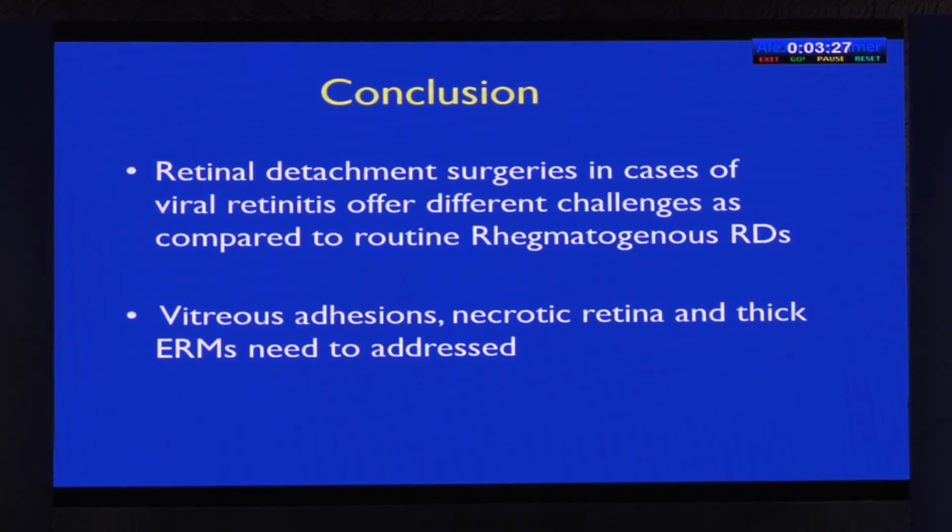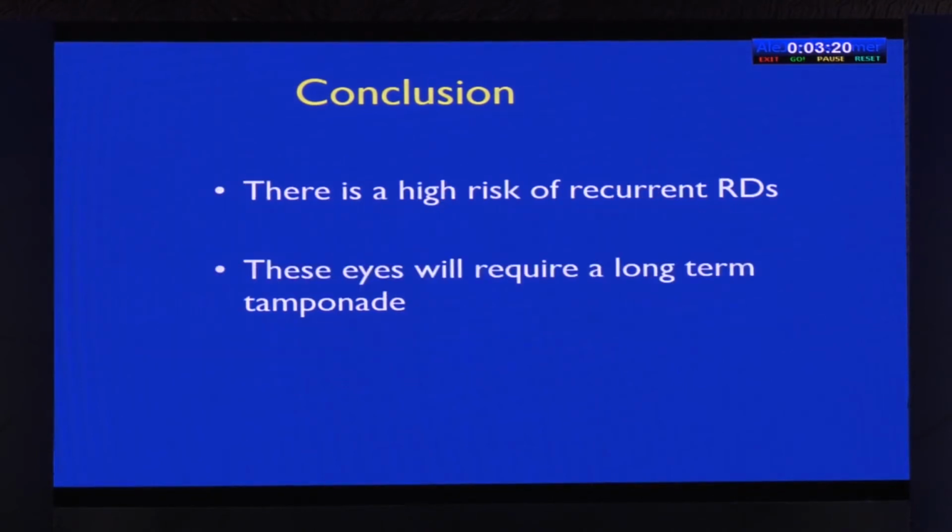So in conclusion, detachment surgeries in cases of viral retinitis are different. Vitreous adhesions, necrotic retina, and thick membranes need to be addressed properly. There is also a high risk of recurrences, and these eyes will require a long-term tamponade.